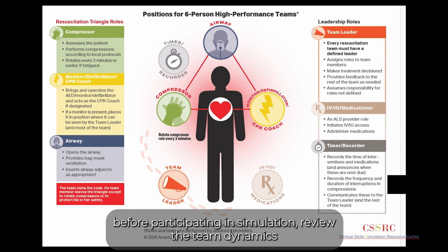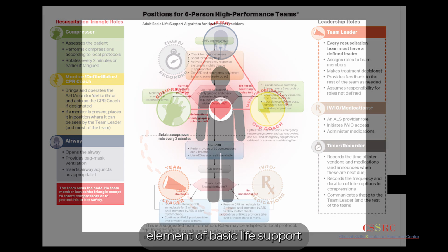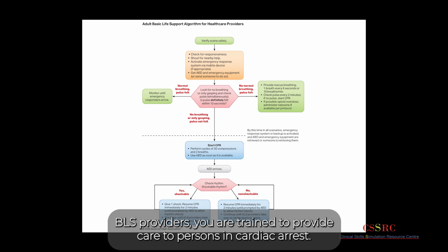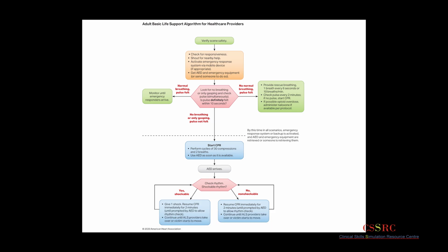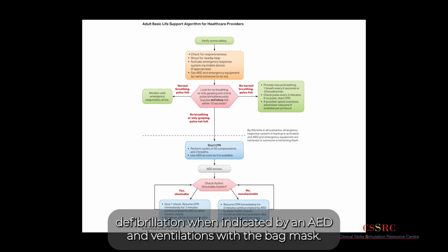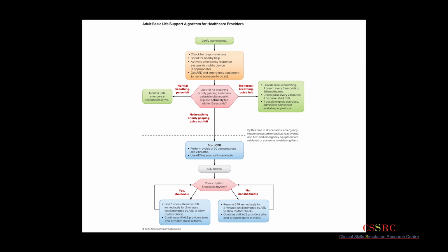Before participating in simulation, review the team dynamics element of basic life support. As American Heart Association and Irish Heart Foundation certified BLS providers, you are trained to provide care to persons in cardiac arrest. This care includes providing high-quality compressions, defibrillation when indicated by an AED, and ventilations with a bag mask.